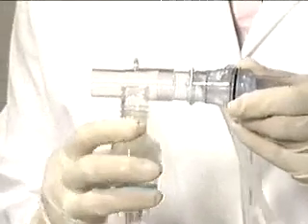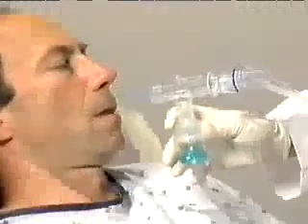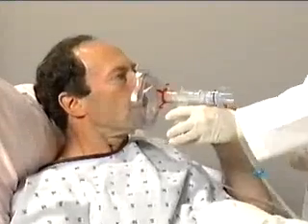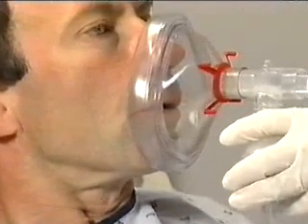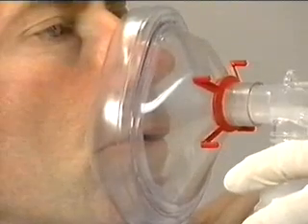Setup is straightforward. Place the nebulizer between the mouthpiece and the device. Place the mouthpiece lightly into the patient's mouth. Be sure that the patient maintains a tight seal on the mouthpiece during the therapy. Recommend the use of a nose clip if necessary. If using a mask, apply the mask tightly but comfortably over the nose and mouth. Instruct the patient to breathe diaphragmatically. Perform breathing through the device as recommended.